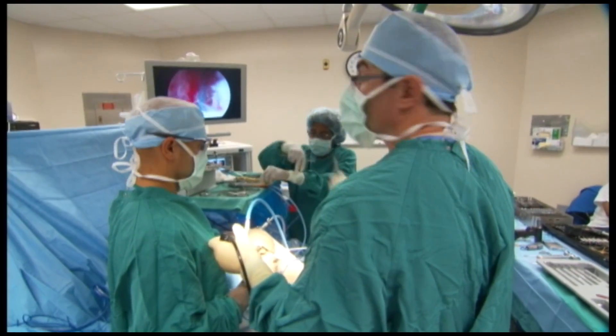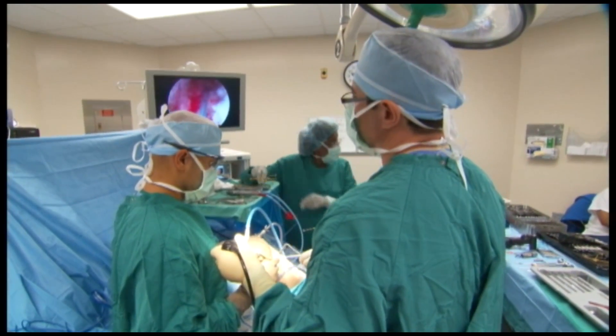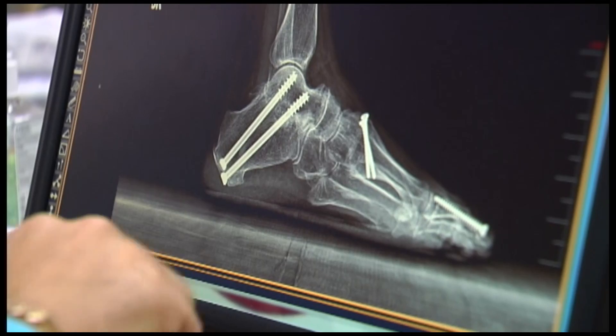These same techniques have been perfected over the years in hips and knees. The ankle presented a unique perspective — it's a very tiny joint, so it makes it a little more challenging. More recently, there's more and more equipment available now to address that.